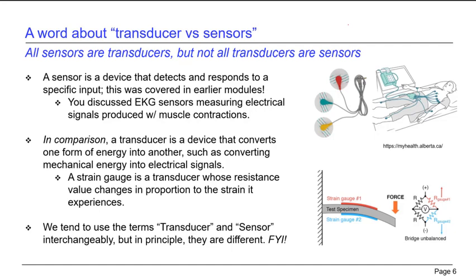Important word about transducer versus sensors. All sensors are transducers, but not all transducers are sensors. Simply stated, a sensor is a device that detects and responds to a specific input. Again, this was covered in earlier modules. You discussed EKG sensors measuring electrical signals produced with muscle contractions.